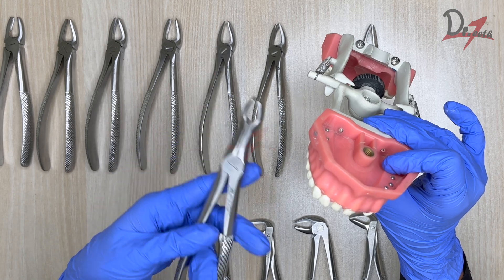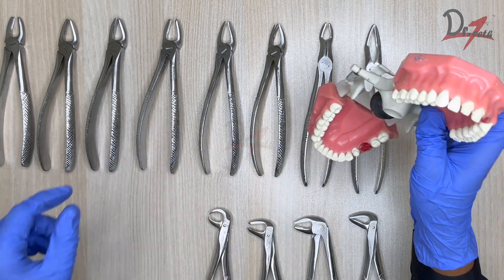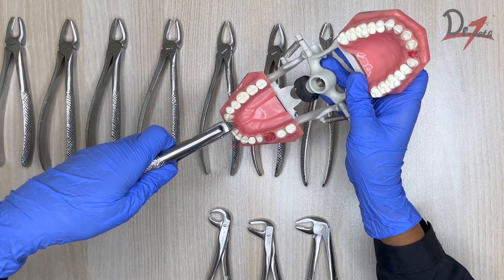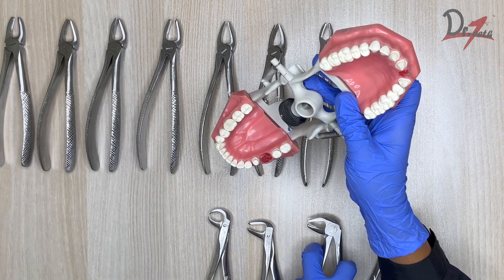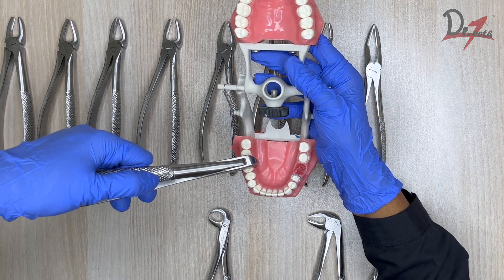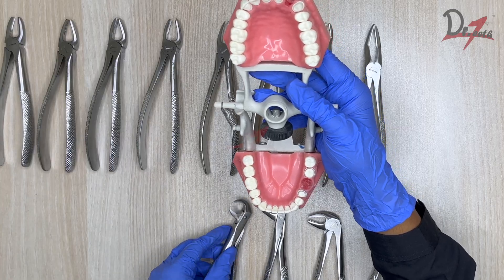The third molar forcep's long beak helps in removal of the third molar which is far posterior. The root forcep follows the same concept. For the mandibular anterior forcep, give buccal pressure, buccal-lingual movement, rotate and take it out. For the mandibular premolar, the same principle applies based on beak design. For the mandibular molar, engage between the mesial and distal roots, give apical pressure, buccal-lingual movement, and take it out. The cow horn engages the furcation area as already discussed.